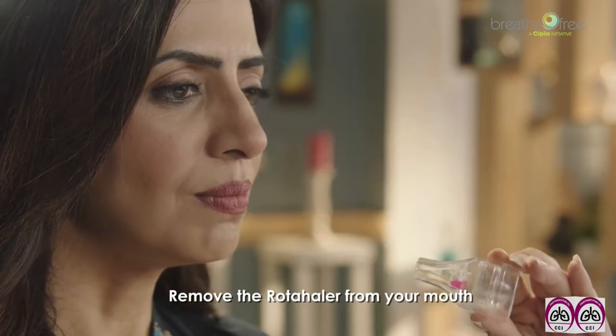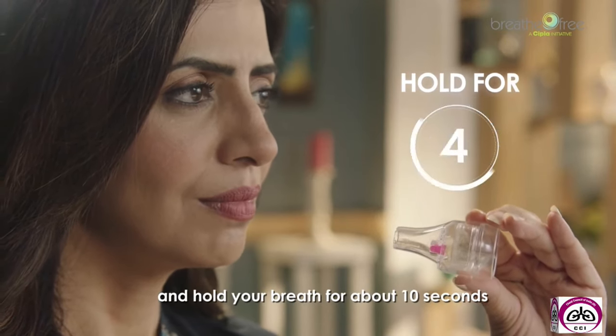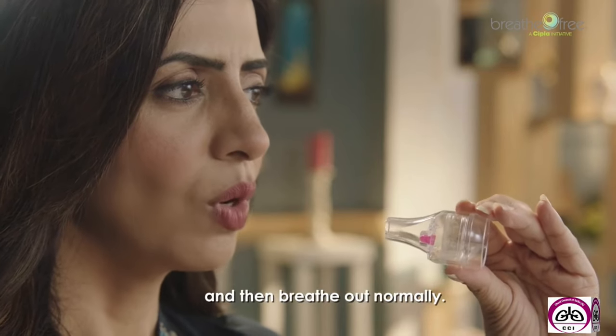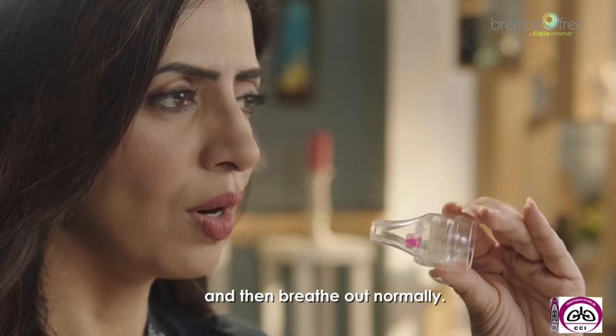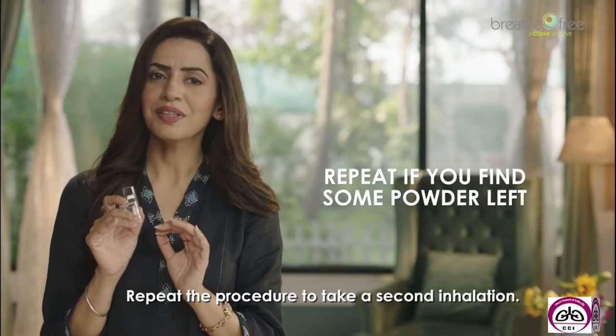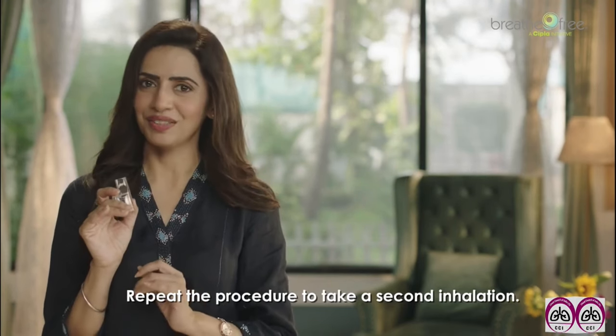Remove the Rotahaler from your mouth and hold your breath for about 10 seconds or as long as you are comfortable. And then breathe out normally. If you find some powder still left inside the Rotahaler, repeat the above procedure to take a second inhalation.